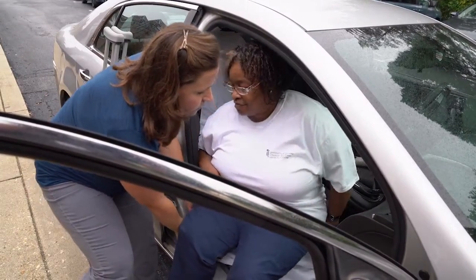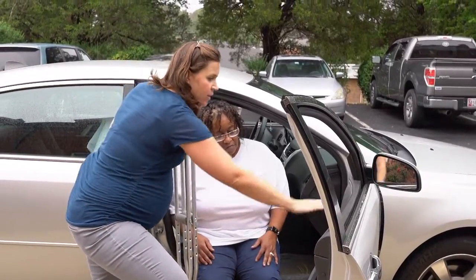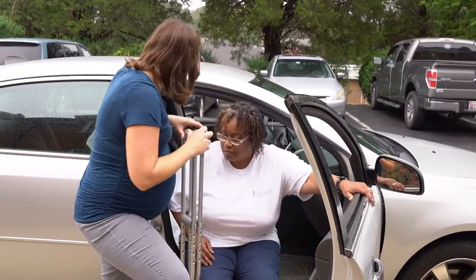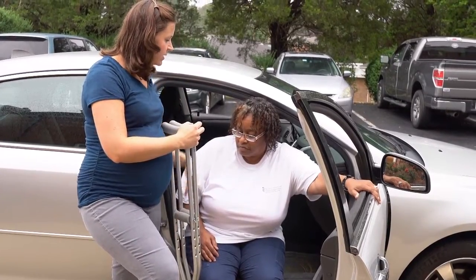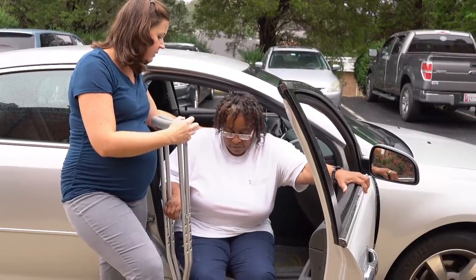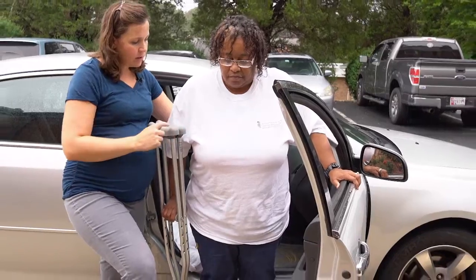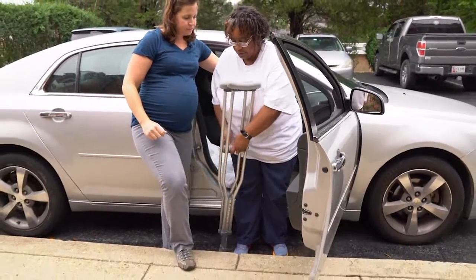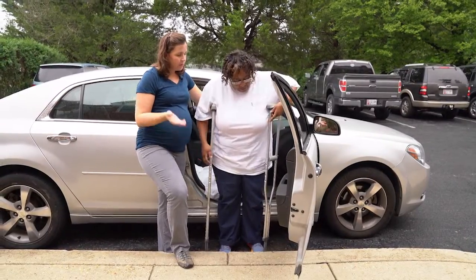You can help me, I'm gonna help you as well. There you go. Good. So to get out of the car, we can use your hand over here on the window. You can use your hand on the seat of the car, or you can use your hand on the crutches. I want you to use what is most comfortable for you, and I will help you as you need it. Very good. Let's go ahead and put one crutch under each side. Very good. And now we're going to go inside the house.